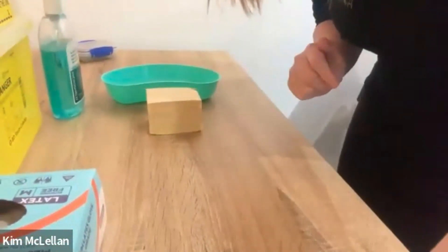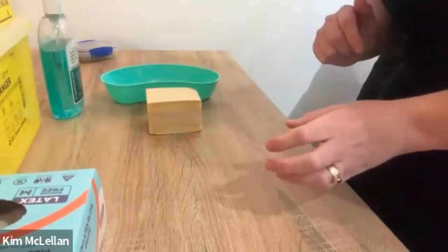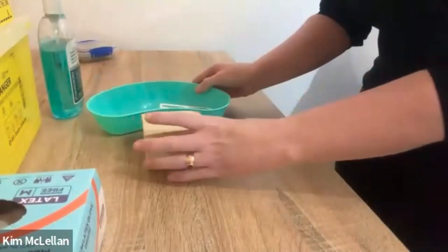Hi and welcome. I'm going to take you through subcutaneous injection. I'm just going to set you up here and we're going to go through how to administer a subcut injection.